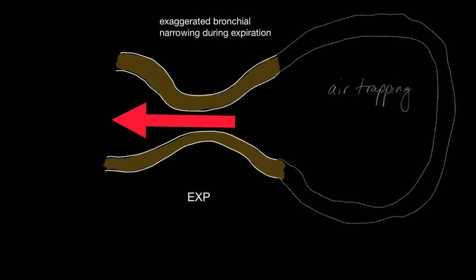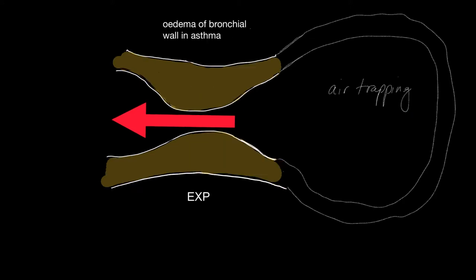One of the problems with prolonged exaggerated bronchial narrowing during expiration is the development of air trapping, which you can see here. This can be seen with the bronchial wall edema seen in asthma.